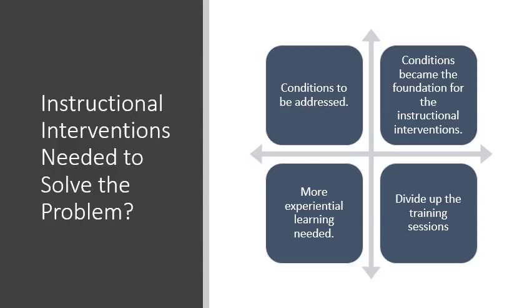These 3 tasks that cause training issues were studied further, and training needed to better address the following 3 conditions. 1. How the angle of the X-ray machine affects the length of the tooth. 2. The participant needs to view an image with proper positioning, which demonstrates a typical appearance of a tooth. 3. The participant needs to evaluate their results and determine how to adjust the angle of the tube head and the location of the sensor to improve the image.